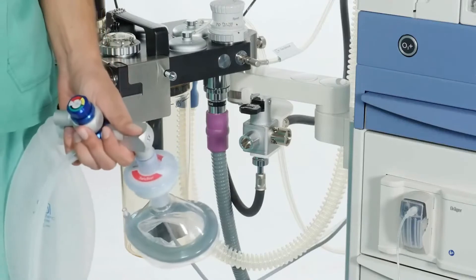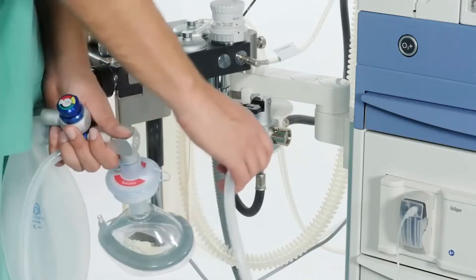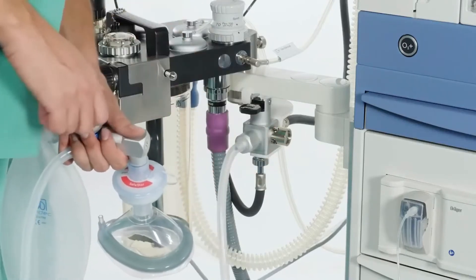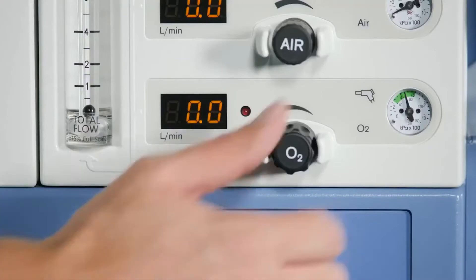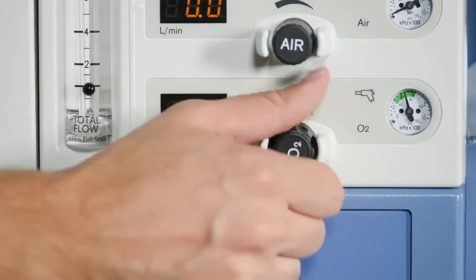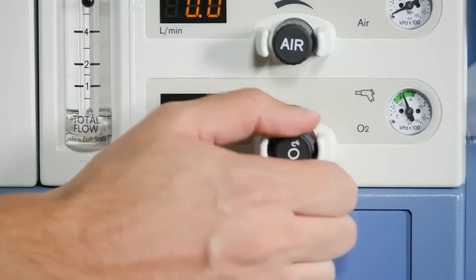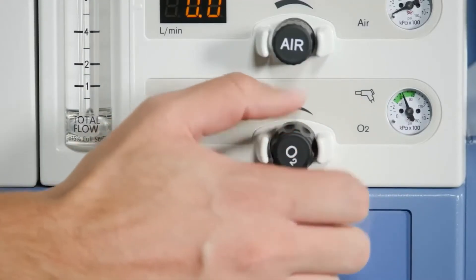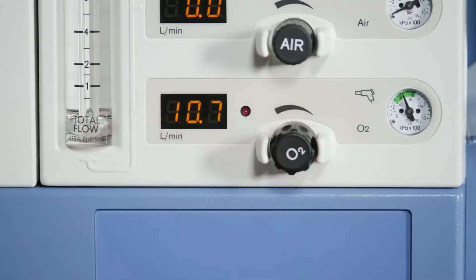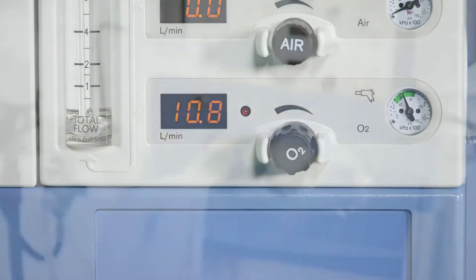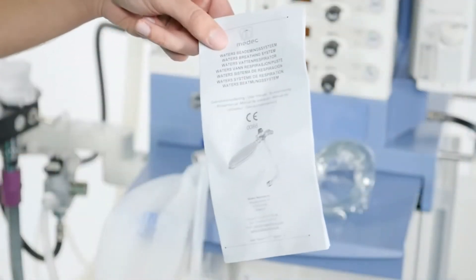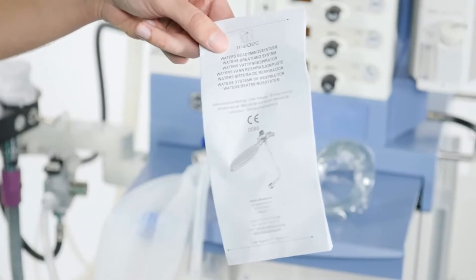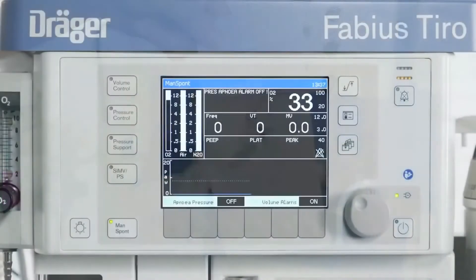Connect the non-rebreathing system according to the manufacturer's instructions. Then set the fresh gas flow. The fresh gas supply must be at least double the minute volume to prevent any rebreathing. During operation, observe the corresponding instructions for use of any non-rebreathing systems.